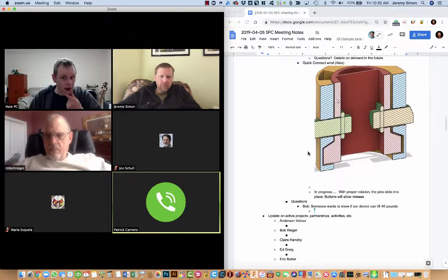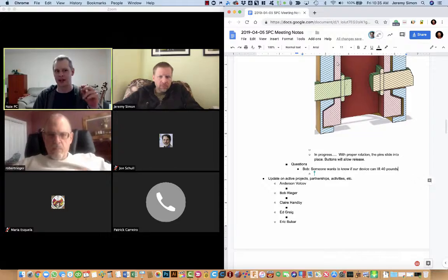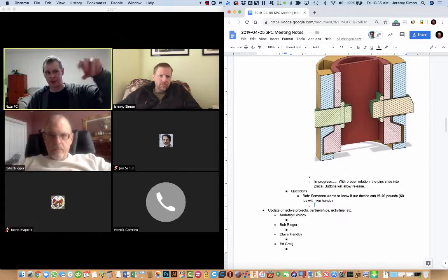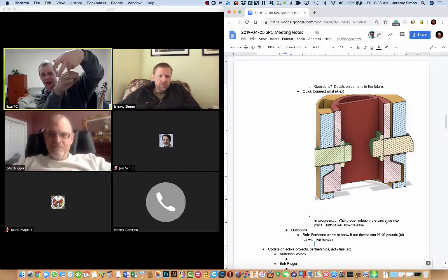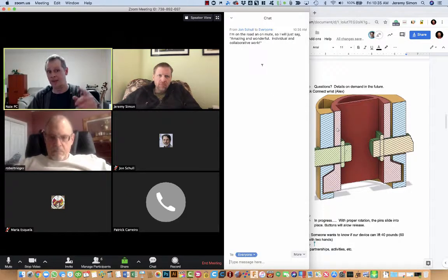Continue. Oh, okay. I'm looking at this as our devices should be able to get us about halfway to a lot of these specialized tasks. But I'm imagining that we start creating a lot of tools to work with the device hands to meet you halfway with certain things. There's a really cool shopping bag handle on Thingiverse. It's just a plastic handle that you slide the shopping bags over, and then you can hold the handle with the bag coming through the two fingers, and it works to hold shopping bags, even with a device hand. So things like that are kind of my approach to this.